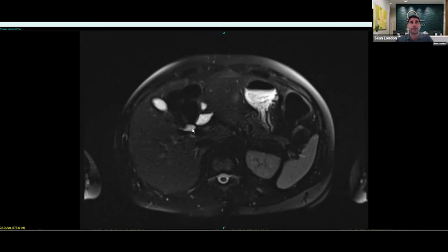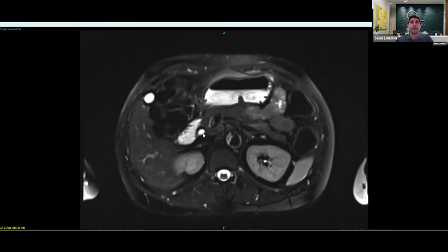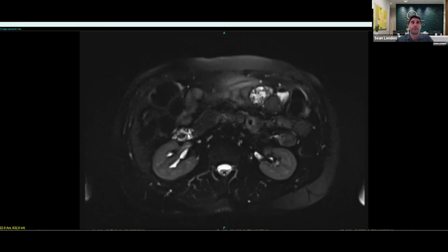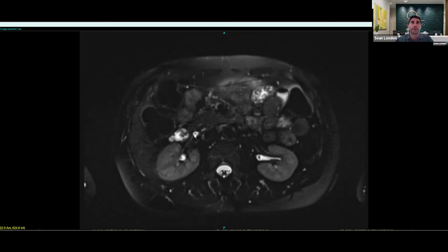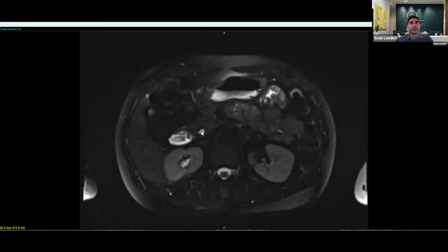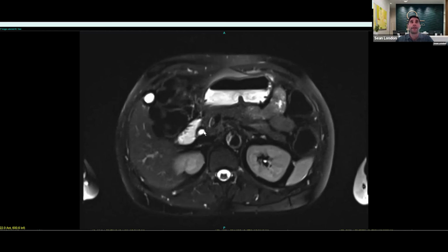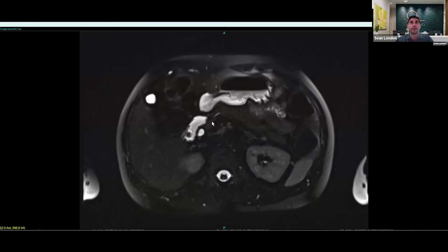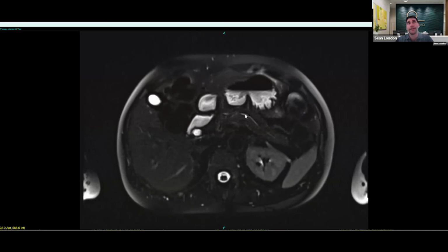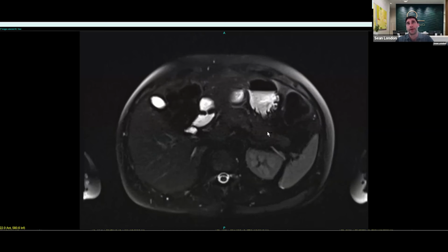Then I look at the bile ducts coming down, which transport the bile from the liver and the gallbladder into the intestine to help digest fatty foods. I don't see anything obstructing. This is within normal limits for size. So no stones in here and no mass within the bile duct. Then I can also look at the pancreatic duct, and it courses throughout the pancreas right there, and it's nice and thin, not dilated, has a nice smooth contour, and I don't see any abrupt cutoffs.